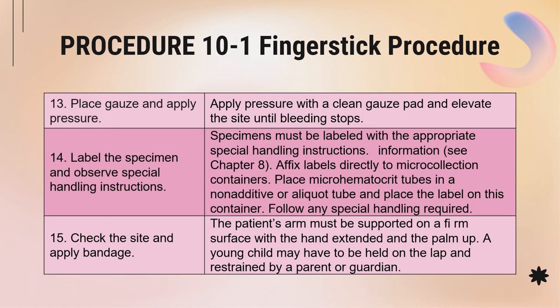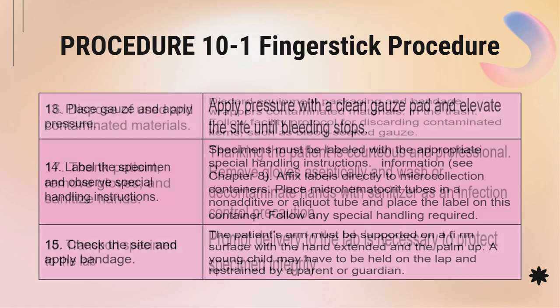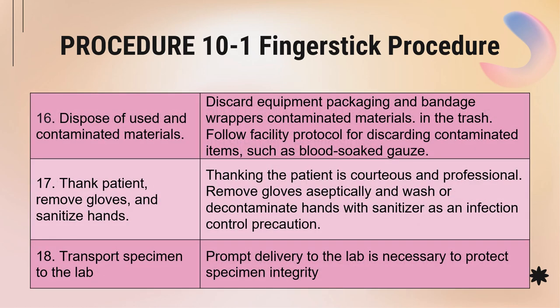13, place gauze and apply pressure. 14, label the specimens and observe special handling instructions. 15, check the site again if there is still bleeding and then apply the bandage. 16, dispose of used and contaminated materials. 17, thank the patient, remove the gloves and sanitize the hands. 18, then transport the specimen to the lab.